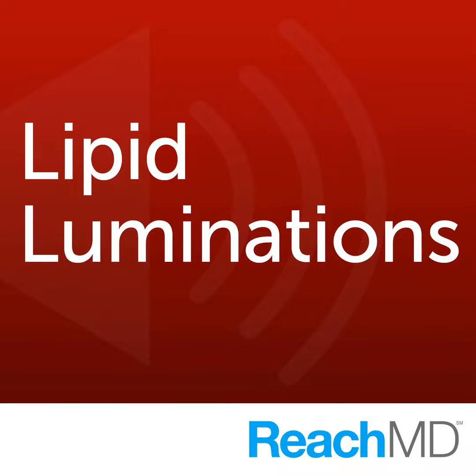However, they can be resolved by coronary CT, and coronary calcium score is a whole different subject, which we won't touch much on today. So, in fact, most people think, and the data shows, that carotid IMT is a good window to the coronary arteries because it's the same type of risk factors that lead to carotid atherosclerosis that lead to coronary atherosclerosis. And so that's why we've come to use that.